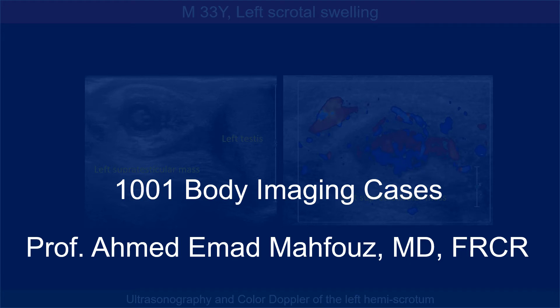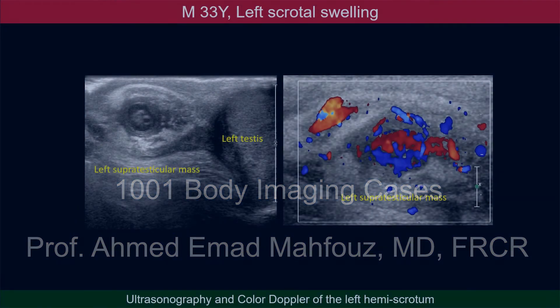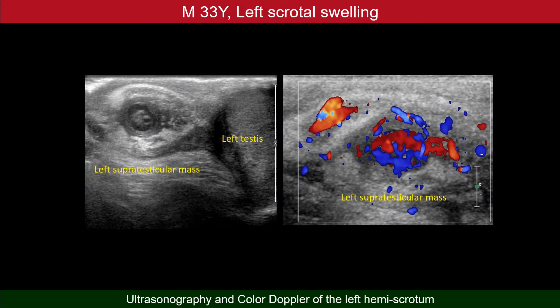Welcome to the body imaging cases. This young male came with a left scrotal swelling. The lesion shows itself on ultrasonography as concentric rings and shows color on color Doppler ultrasonography.